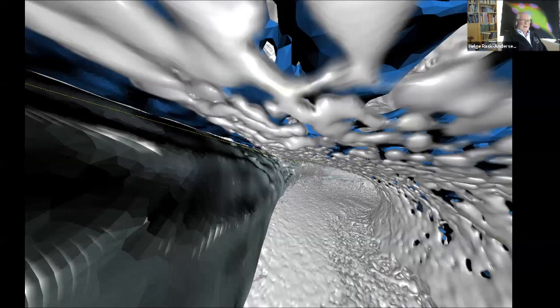And we can put in an electrode and we can see exactly how the electrode passes into the scala tympani, how its location is in relationship to the lateral wall, which is also a very vulnerable structure that we have to take care of and not to damage in case we want to maintain hearing.